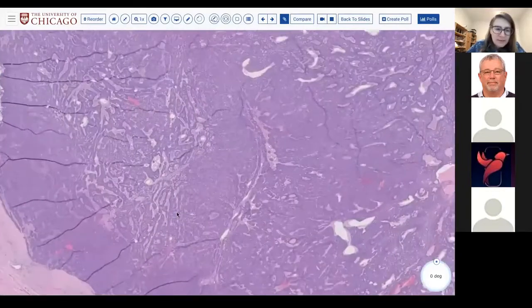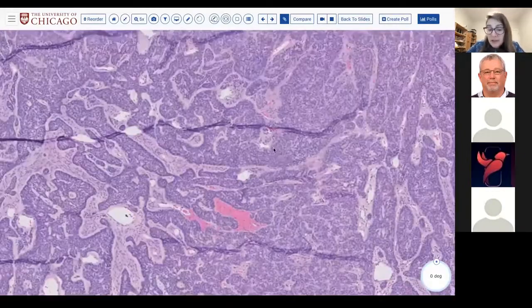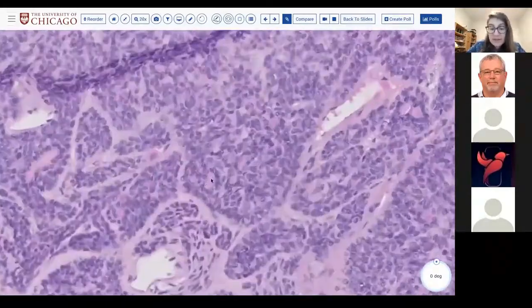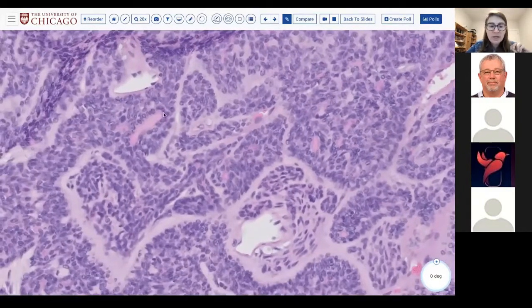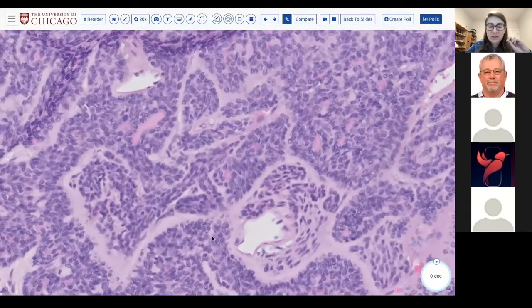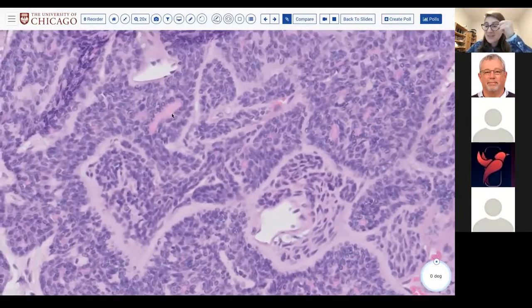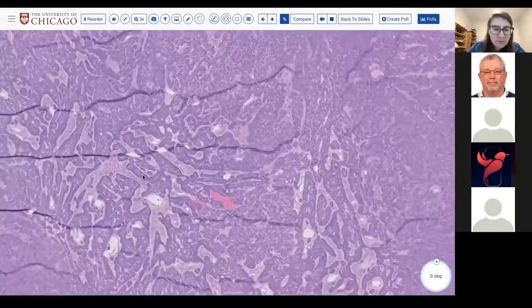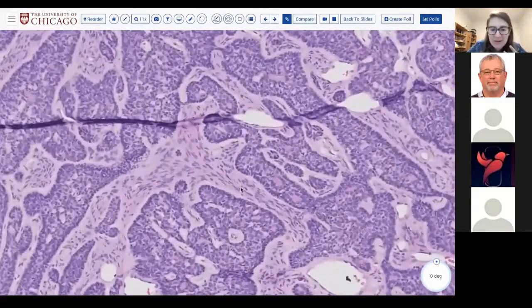And again, showing you that so-called tubulotrabecular architecture of a basal cell adenoma with very characteristic, very brightly eosinophilic hyaline stromal material. So these stromal bands can either occur between the nests or within the nests as little globules. So that's a good feature for basal cell adenoma. And as you noted, here it is. Here's that very cellular spindled stroma that would be positive for S100.